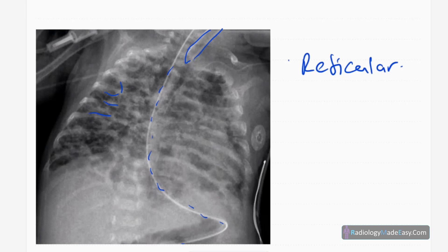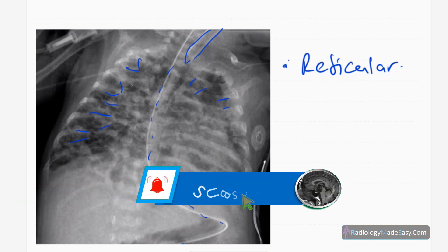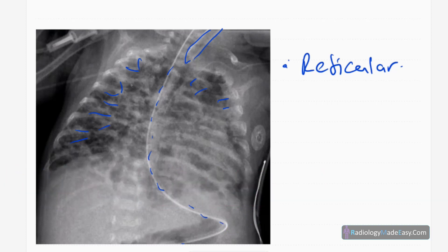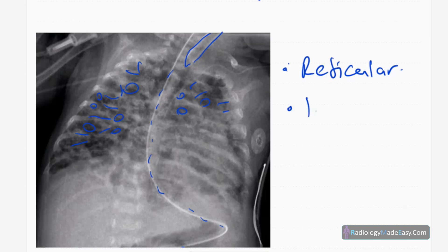In the lungs you can see reticular opacities — multiple reticular opacities in both sides of the lung. The heart is shifted to the left, but because the X-ray is rotated, that is an artifact and not abnormal. There are also multiple lucent areas, and the lung volumes are slightly reduced in this patient.